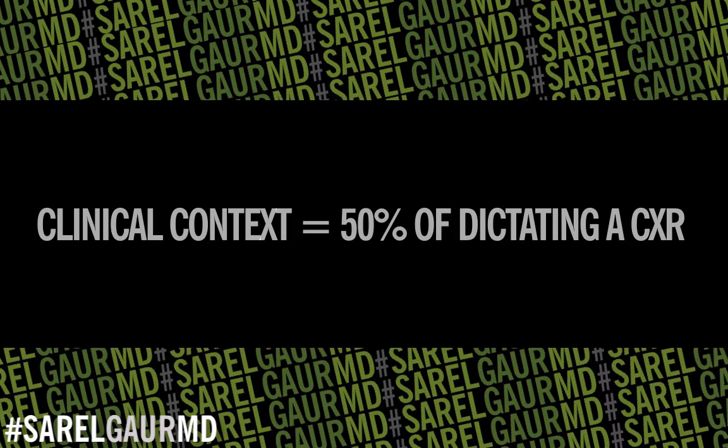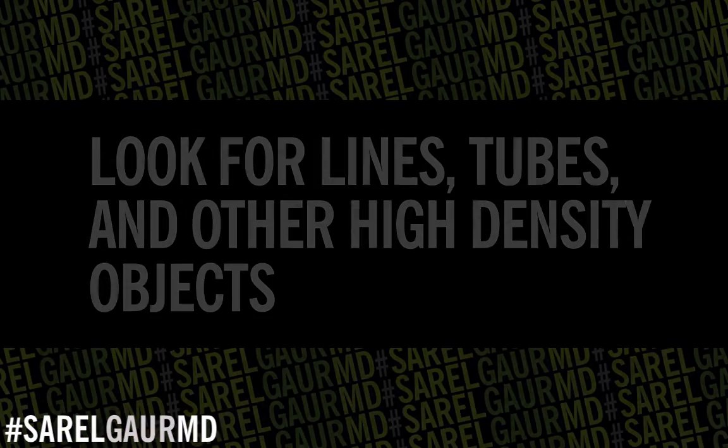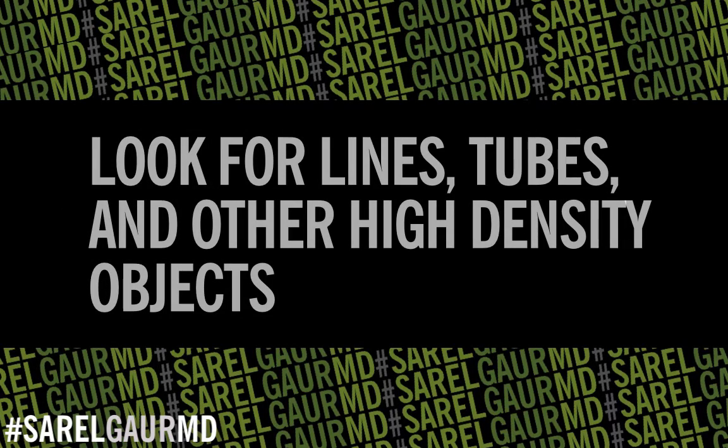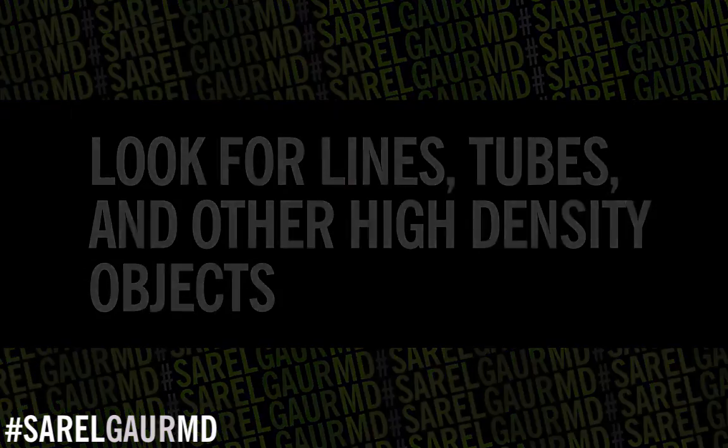Once I pull up the chest x-ray, the first thing I do is some accounting. I look for high-density objects such as lines and tubes — including sternotomy wires, prosthetic heart valves, and things of that nature. Importantly, I'm looking for malposition: an ET tube pushed too far, a central line not properly positioned, or a nasogastric tube going into the lung.